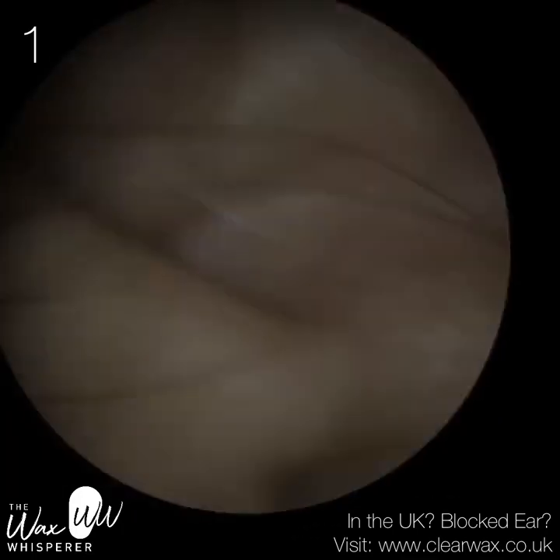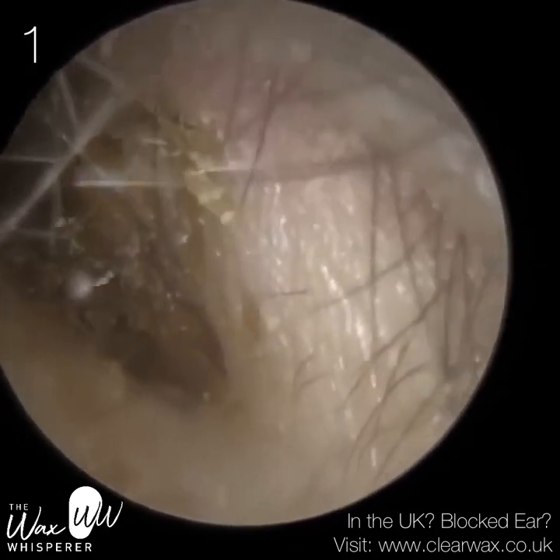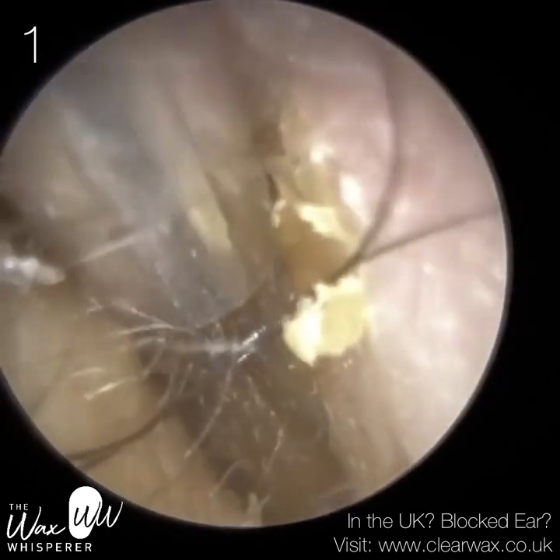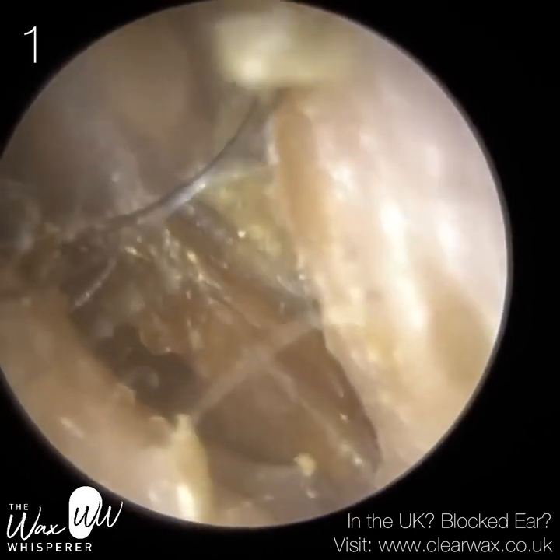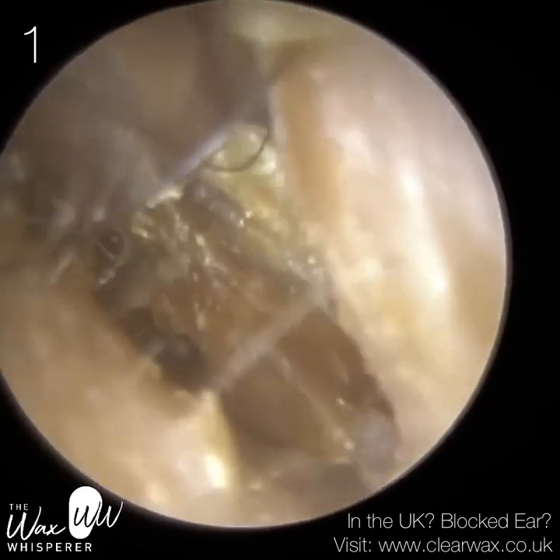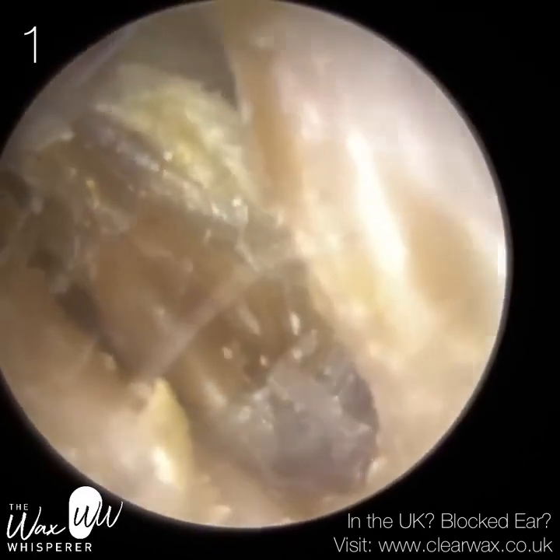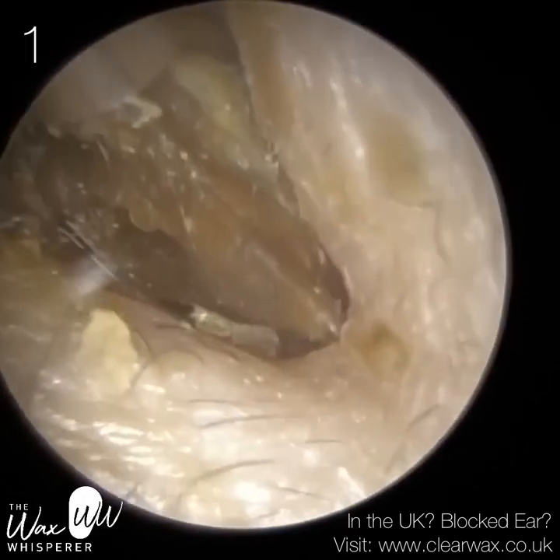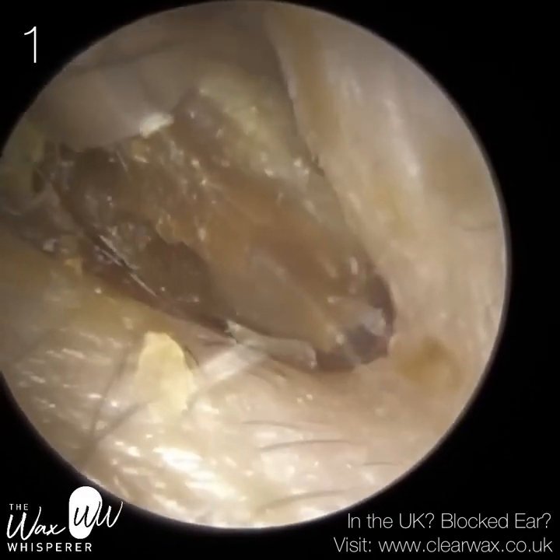This patient is actually a family member. It's my aunt, and she's given me permission to upload this. I have encapsulated 3 separate visits. So unfortunately my auntie is suffering from an ear infection, more specifically otitis media with effusion. So otitis media means a middle ear infection, and effusion is fluid. So she's got an infected middle ear cavity and there's fluid buildup in there.